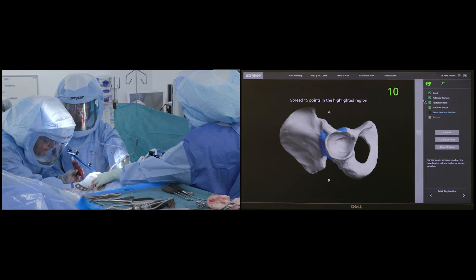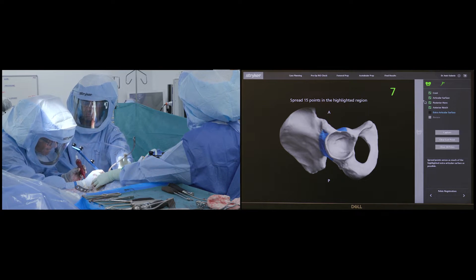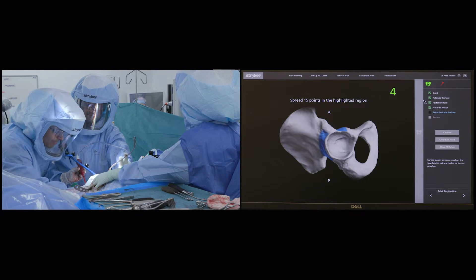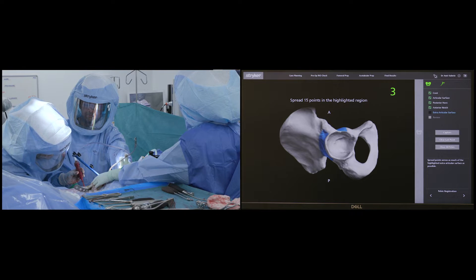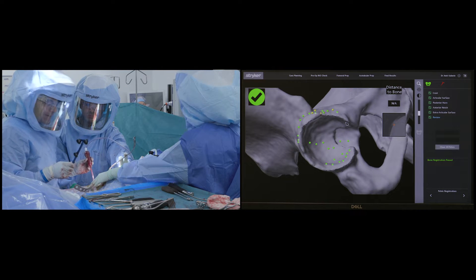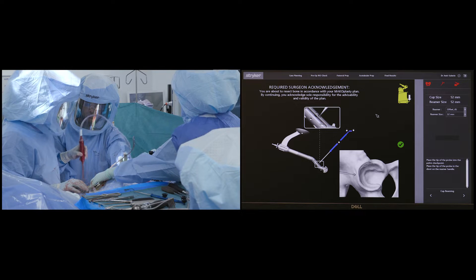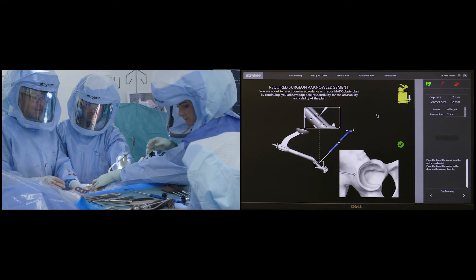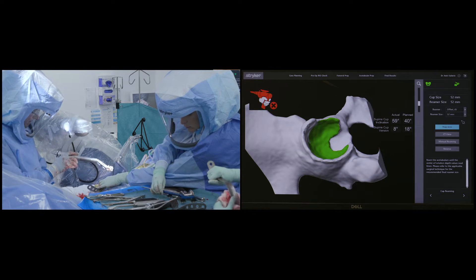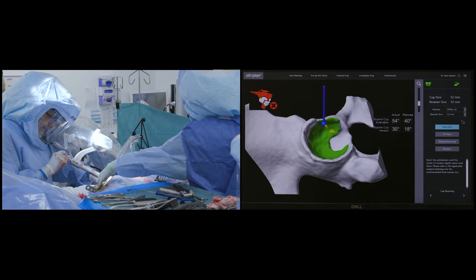In this patient a size 52 cup was templated. One of the important benefits of robotic surgery is that only a single reaming pass is required to prepare the acetabular bed for the final cup. This greatly reduces soft tissue damage and blood loss, and eliminates the need for intraoperative x-rays, improving the efficiency and flow of the operation. Once the acetabular bone is mapped, the size 52 reaming basket is positioned inside the acetabulum, the robotic arm is brought in, and the reaming handle is connected to the basket.